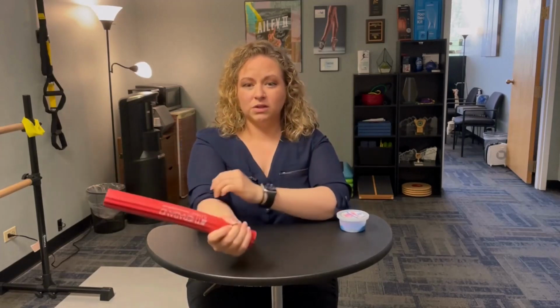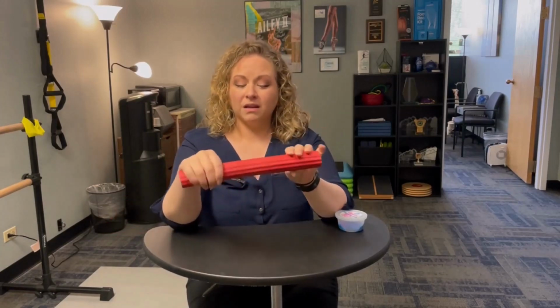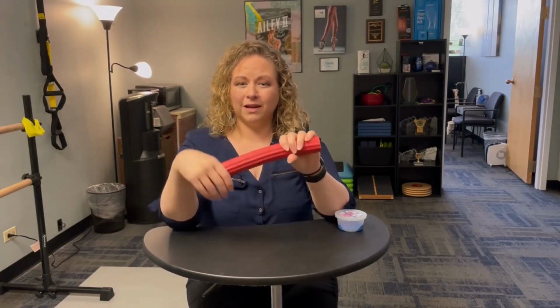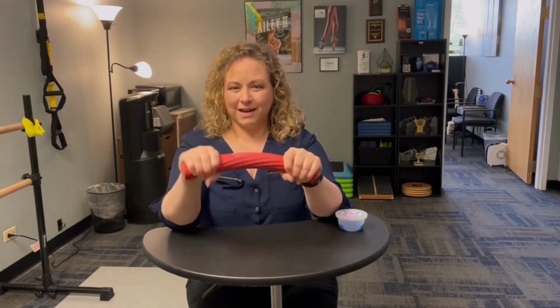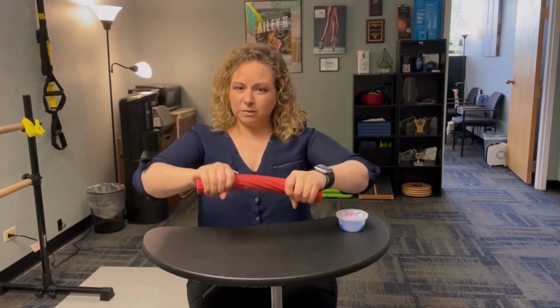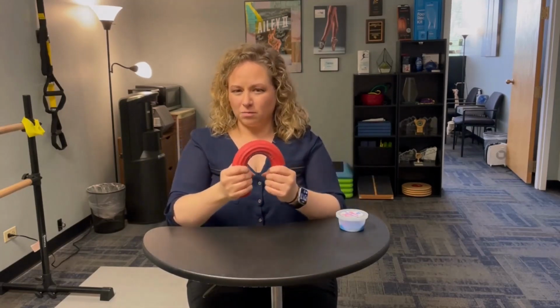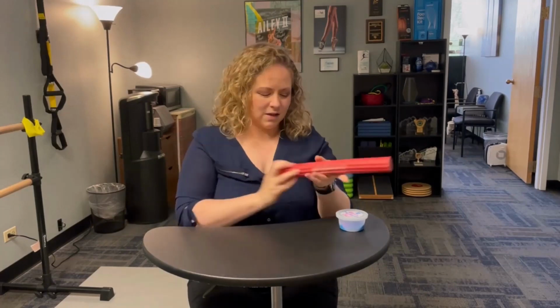So with this, we can do some different wrist exercises and forearm exercises, which can be found in a different video. But this is also pliable, and so we can twist it and bend it and do all kinds of different things. So this can be a nice way to work on some grip strength and wrist and forearm motion and that kind of thing. So something like this can be a nice option.